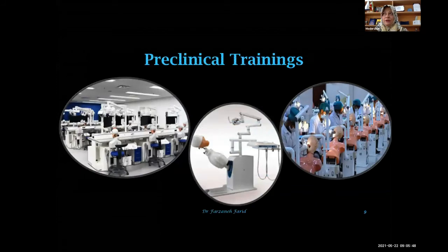Now let's go one step forward to preclinical training. As you know, we used to have dentiforms or dental forms, and later we had phantom heads. With the phantom heads, students begin to practice dental preparations before they go to the patient and work in the patient's mouth.